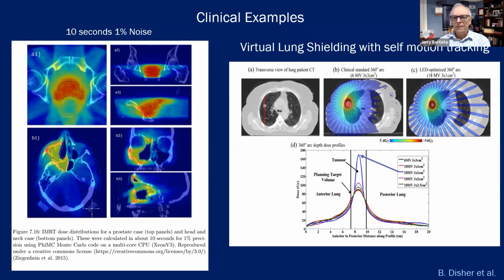Kind of a radiosurgery treatment, but not quite. If we shrink the field in this direction to 1 centimeter, we will cause a lot of disequilibrium.